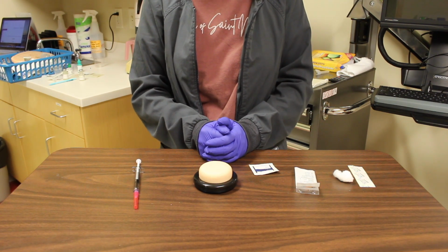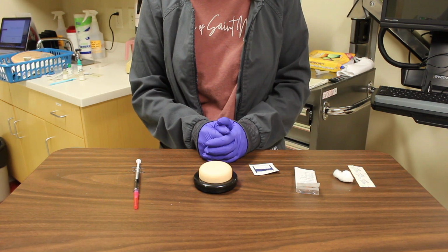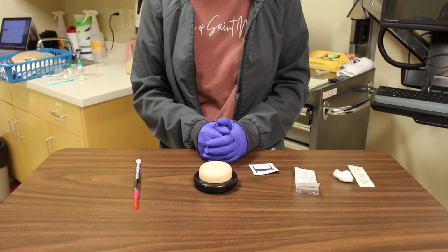This is the skill administering subcutaneous medications. Complete the medication guidelines, including the 3 checks against the MAR, identifying the patient using 2 forms of identification, and educating the patient about the medications they will receive. Complete the 6 essential tasks.